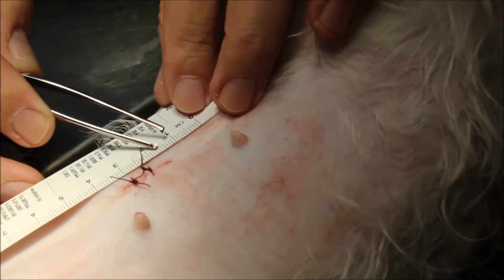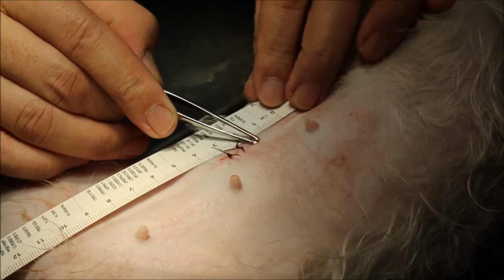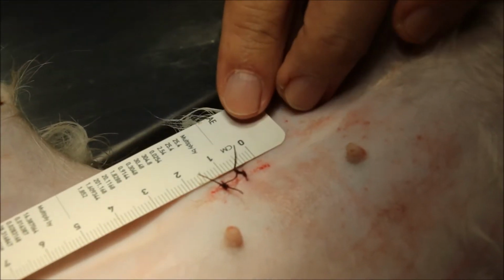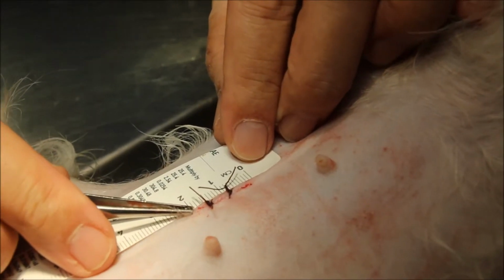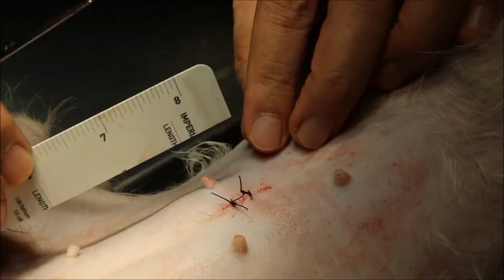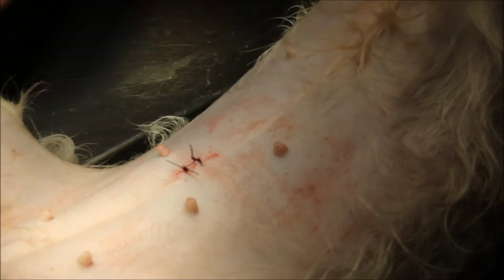So normally from here, I will estimate for this small breed about 1.5 centimeter. My incision starts here, 1.5 centimeter from the umbilical scar. So from this 1.5 centimeter, then I will take the scalpel blade and cut more or less 1.8 centimeter. So that this is the shortest skin incision which is available to take out the ovaries and the uterus.